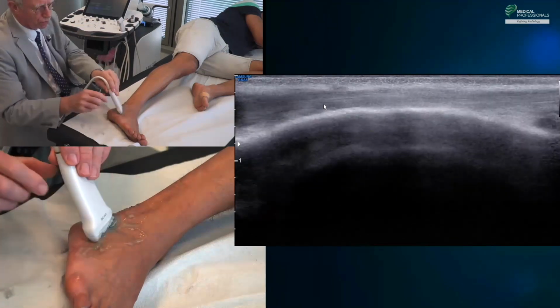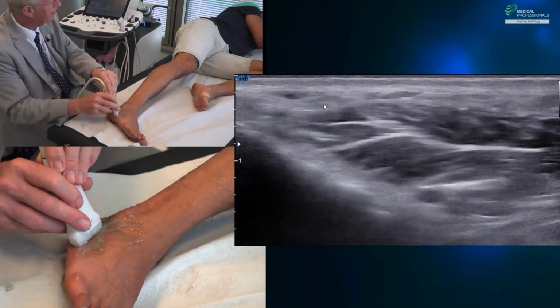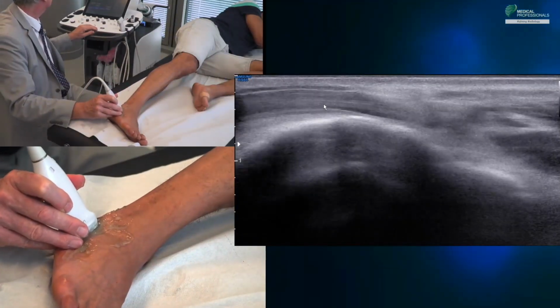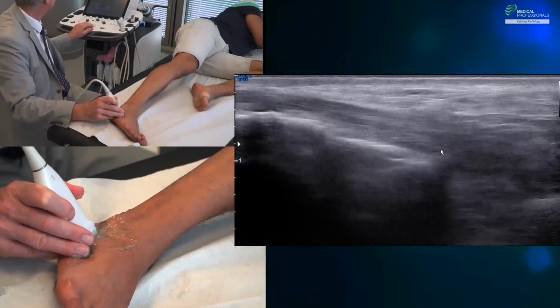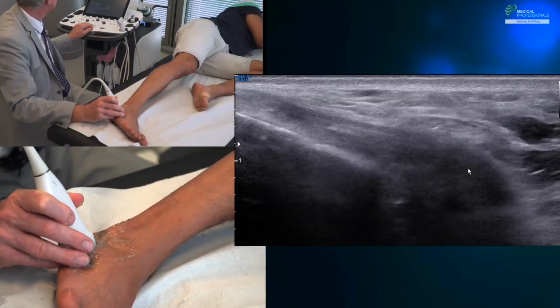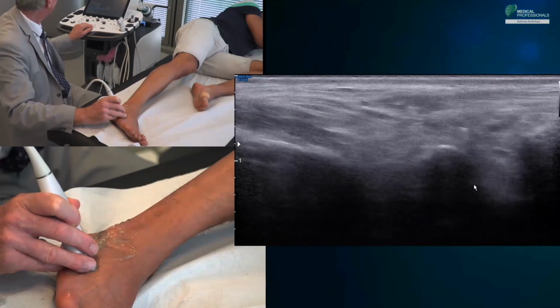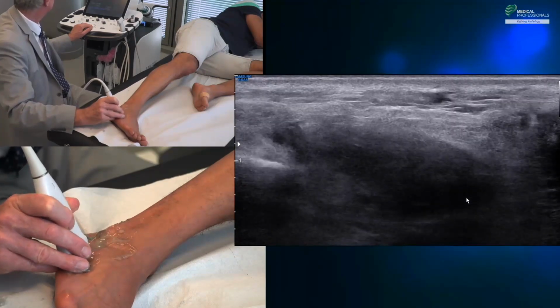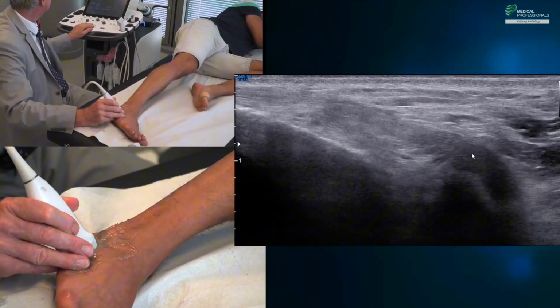We then lower the probe slightly toward the sole of the foot, and we know that there we find the peroneus longus. We follow it until it passes over the cuboid, where it is reflected, and at this place, as in this patient, it may contain an accessory bone. The os peroneum is important to analyze because its rupture can lead to that of the peroneus longus tendon.